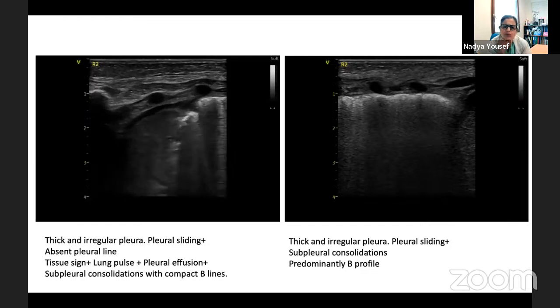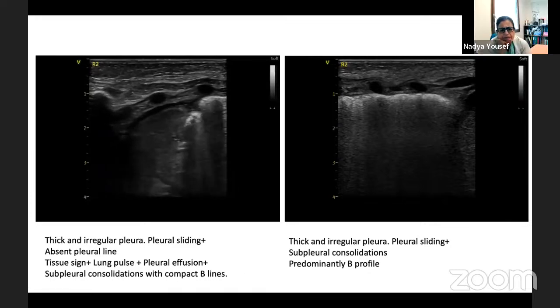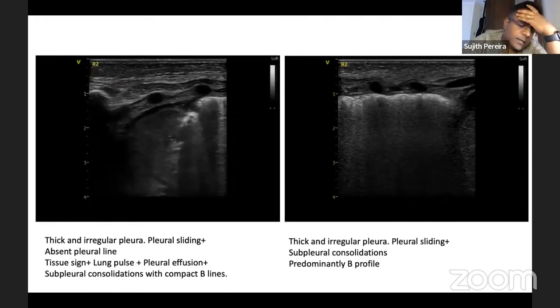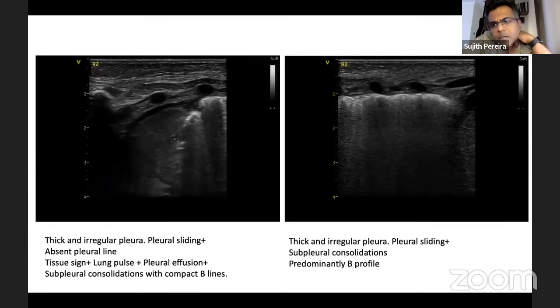Thank you for sharing. Which side was the pleural drain inserted antenatally? Antenatally on the right side. It's interesting, the lungs are quite asymmetrical, aren't they, when it comes to the severity of the interstitial syndrome? Yes. There was bilateral disease antenatally, though the obstetricians inserted the chest drain on the right side because there was more fluid on the right side, and there was a good effect to it. But there is some underlying lung disease because at some point, the duct was shunting bidirectionally.